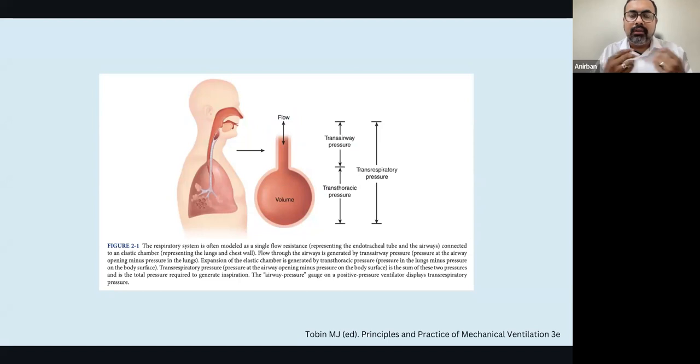So whenever you inflate a balloon, you need some effort to overcome the elastic recoil of the balloon. So for that, you need to generate some pressure so that it overcomes the elastic recoil of the balloon and expands the balloon against its elastance. So we are dealing with two forces here, the resistive force and the elastic force.